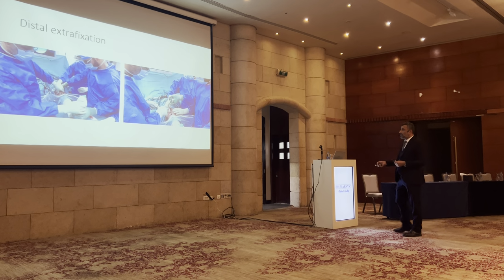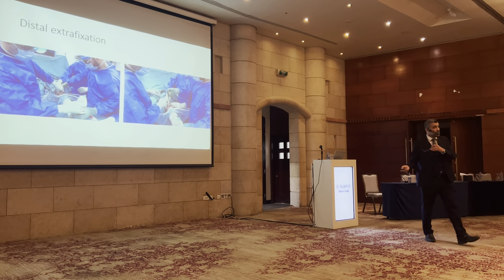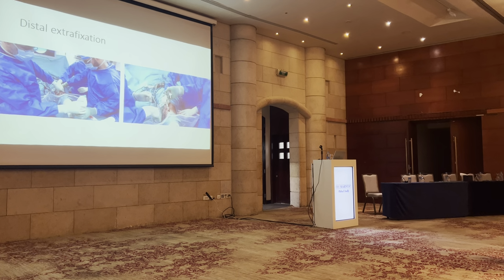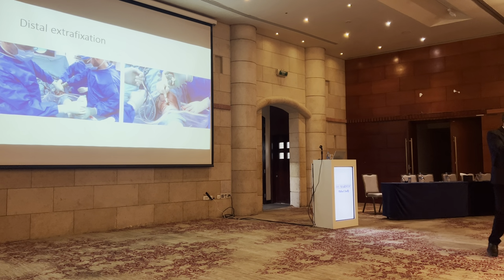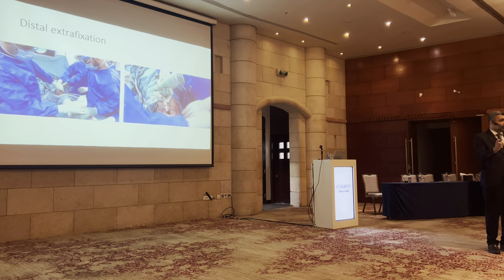So I think we can decrease the risk of infection. Extra fixation advice to use this in all inside techniques, because I have had two times, one of them a professional player, when I do tensioning, tightening, the tightrope cut.